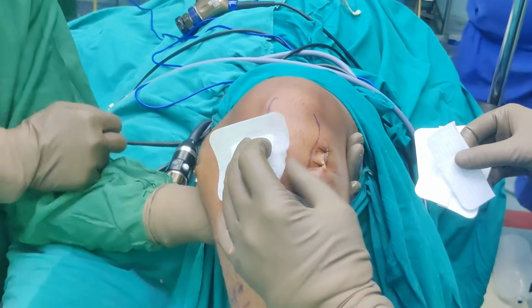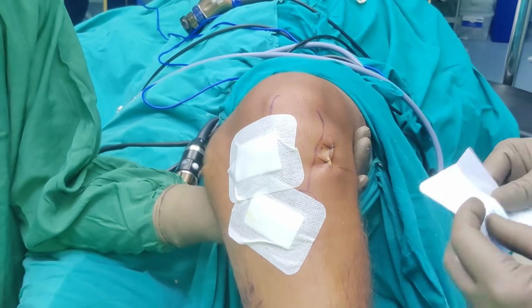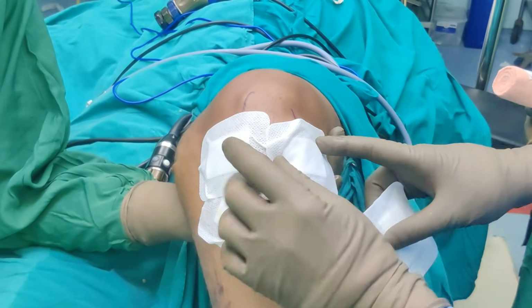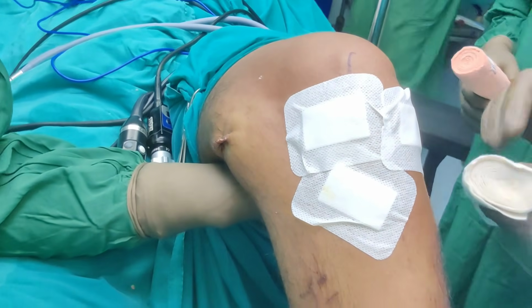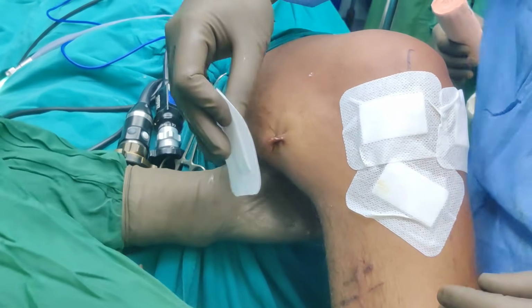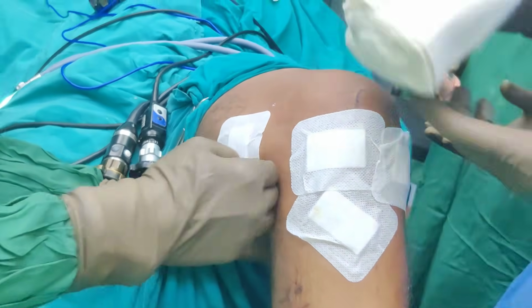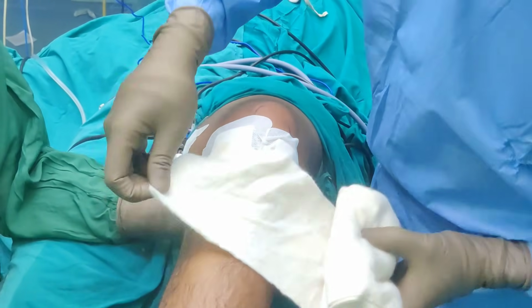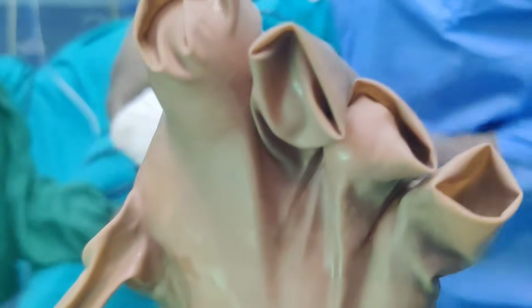This is our anteromedial portal. These go for our anterolateral high and low anterolateral portals. And last but not the least, don't forget the posteromedial portal. Sometimes you're struggling, and when closing up you can forget that you have made a portal here as well. So this is all done. We are just going to use some crepe bandage and some wool band, and then we'll put him in a ROM brace and we'll start rehab from tomorrow.